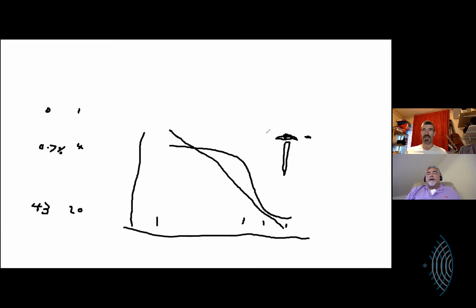Now, what part of this diagram is called the map? The shape of this curve is called a map, and they have different shapes. There are different shapes that are rounder or smoother, and that's one of the things that changes when you change your application. So when you go from musculoskeletal to gynecology, they've looked at where the money is in terms of being able to see the difference between things.